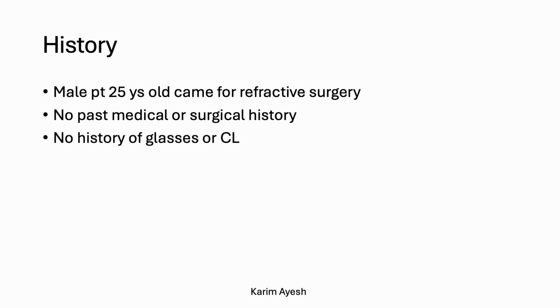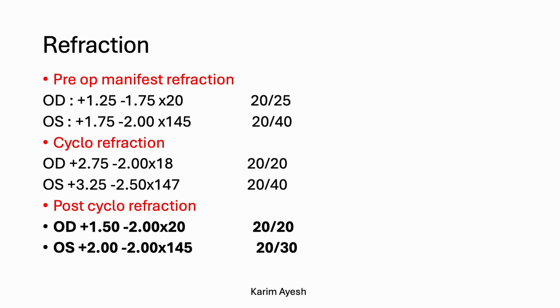Male patient, 25 years old, came for refractive surgery, no past medical or surgical history, no history of glasses or contact lens. He doesn't like to wear glasses at all. Refraction, as you see, is summarized here: post-cyclo refraction is seeing better than pre-cyclo, but still the improvement of vision is not so much.